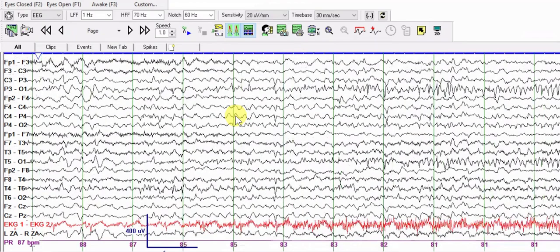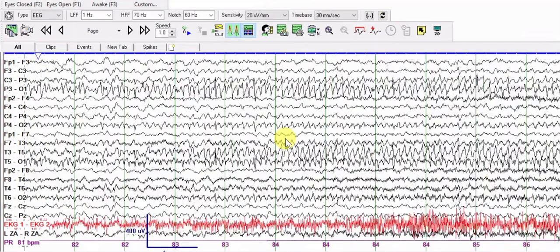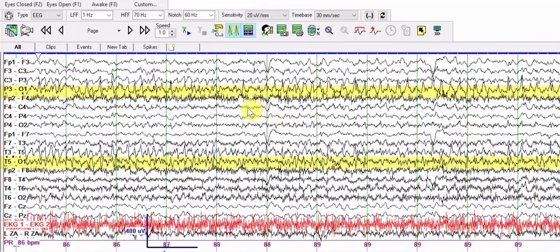Now we start seeing something really interesting — I'd ask you to pause and identify it. Keep an eye on P3O1 and T5O1: we are starting to see a fast, rhythmic activity in these regions in the left posterior quadrant. At 20 microvolts per millimeter, increasing the gain to 7 makes it more prominent. You then see an evolution in frequencies and amplitude in those two channels, and then high amplitude spikes and sharp waves in that distribution.